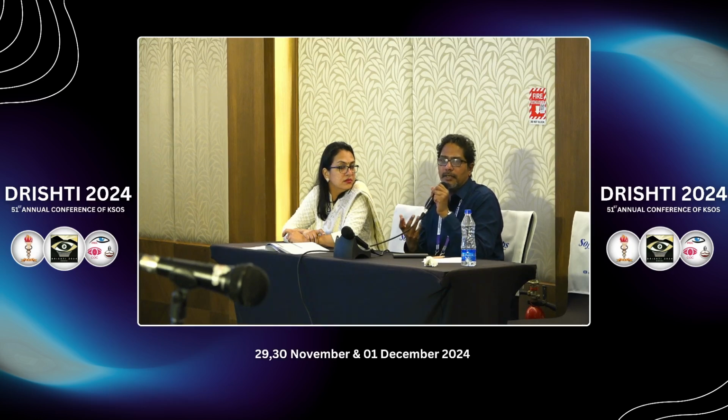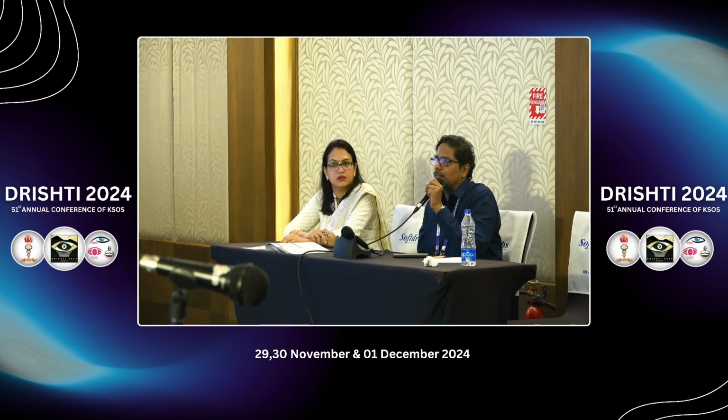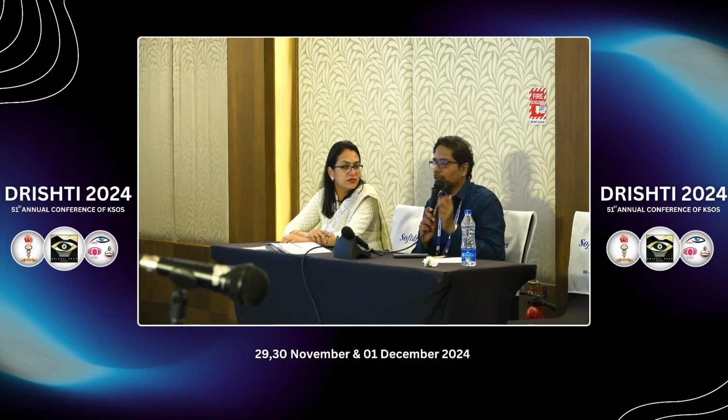Even though we want clear media, with the presence of a multifocal IOL, irrespective of whatever type, and also the presence of an ICL in some of the high myopes, we have not had much of an issue with visualization. We can usually get away with a little bit of altering the axis of the globe when you're trying to visualize. So I feel it's not a big no-no as regards posterior segment visualization. So it is okay.